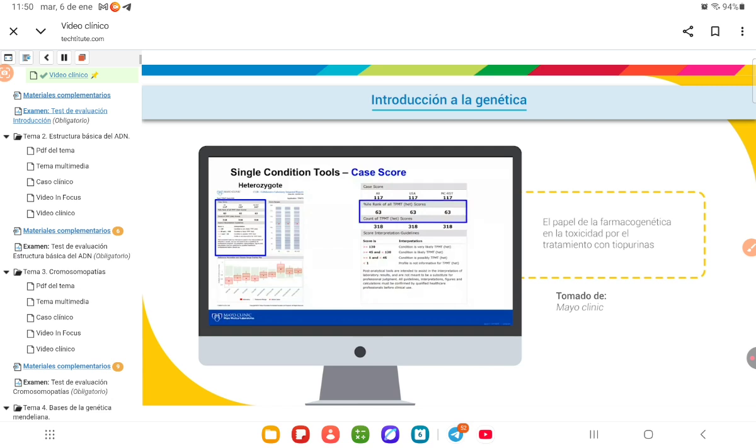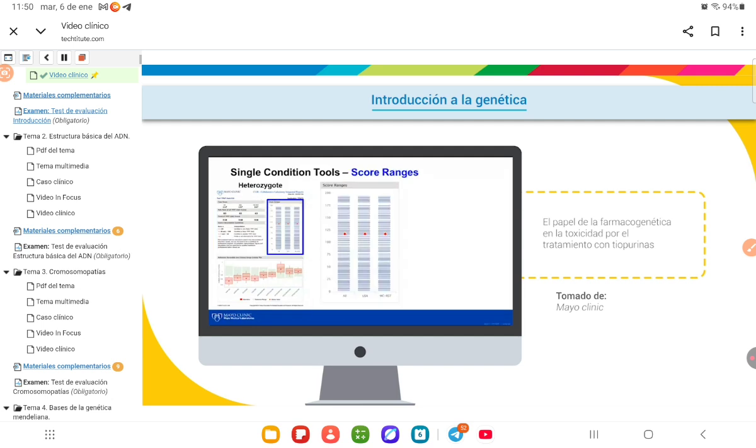Before going there, I would like to underscore one more time the concept of percentile rank as an objective and quantitative measure of likelihood of disease. The score range plot is a graphical representation of all scores, each represented by a band. In this example, the choice of aggregator is the United States. The utility of comparing separate score ranges is demonstrated by this example, showing scores for a condition detected by newborn screening. The Swedish program can compare the score of a patient to increasingly larger number of cases, 12 of their own, 100 from all over Europe, and 1,000 worldwide.